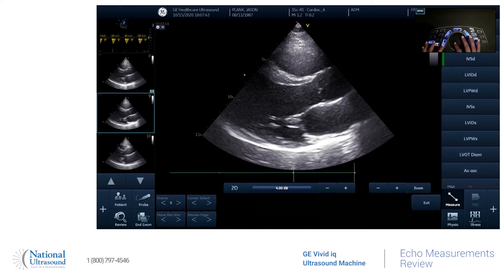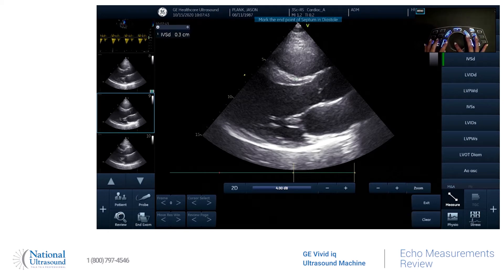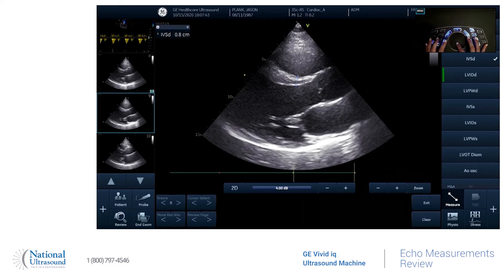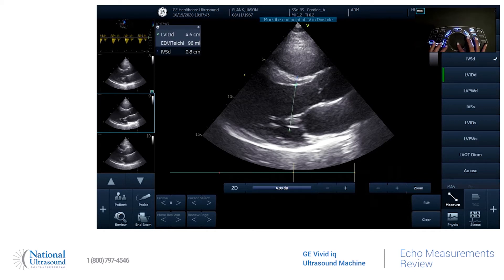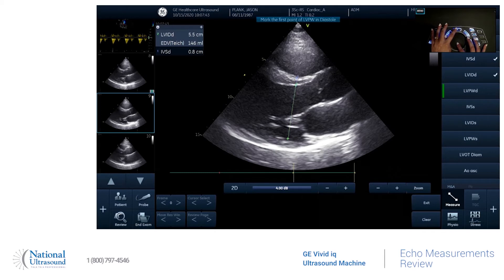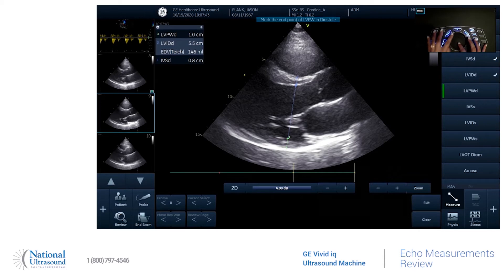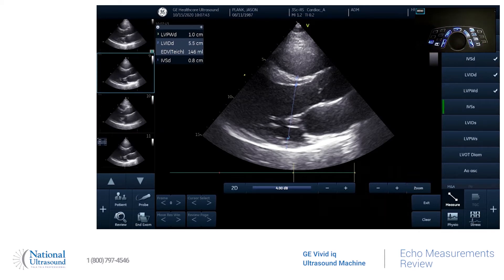We're going to go to the septum. And then the next measurement is automatically going to come up for the ventricle. And so we'll go ahead and store that.